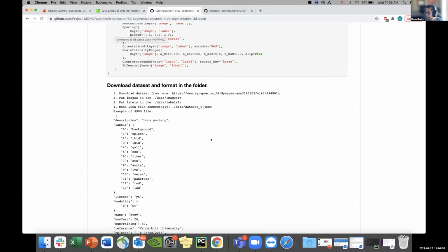Okay, and then I think actually one more came in. So is it usable with echo image key point detection, or is that possible with sort of a transfer learning approach or a vanilla approach? Well, so these are all the downstream tasks, right? So I think for your application, I would suggest to just take the transformer encoder of the UNETR, which is just a ViT model, and then try to use your specific detection heads on top of that. I think there are already some works, such as the work by Facebook called a DETR model. So I think all of those approaches should be readily available or applicable to this scenario.